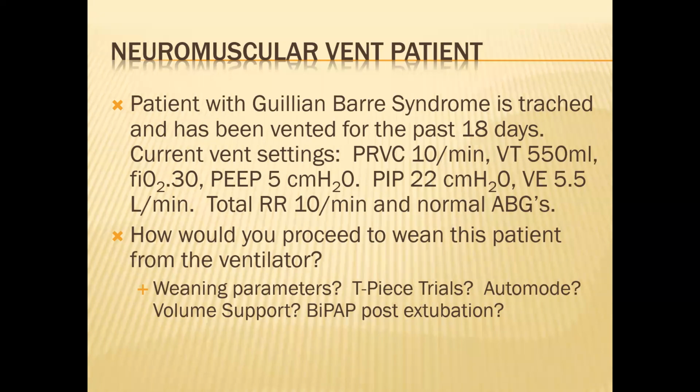Yeah, so if they're understanding your instructions and then they perform it well, you get a good value. But patients that don't follow instructions very well, you may not be getting the best effort. And if you just do it for 5 seconds, you're not seeing their maximum effort. So like the textbook says, keep coaching them to try harder, to try to get some more deep breaths. Because you'll see after about 10 seconds, they're going to have a huge effort. So I know you were being facetious, but yeah, sometimes 5 seconds is not long enough to see their maximum effort. But don't just occlude it and don't say anything.